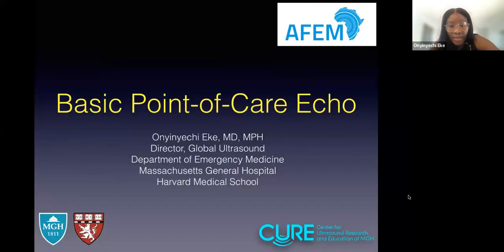Okay, so as I said, I am the director of global ultrasound in the Department of Emergency Medicine at Massachusetts General Hospital and Harvard Medical School. It is great to be with you all today. We'll be talking about basic point of care echo. So throughout the lecture, feel free to stop me at any point. Faith, if you could look at the chat and let me know if there are questions that I can answer as I'm giving the lecture, I would be happy to. And hopefully we will also have time at the end of the lecture to go through some questions as well.